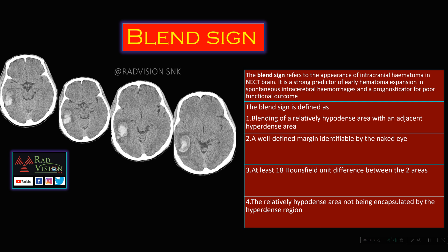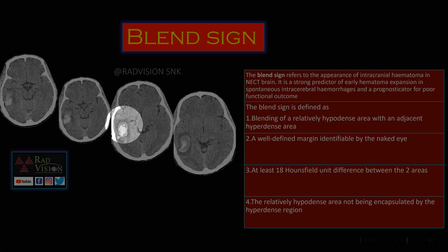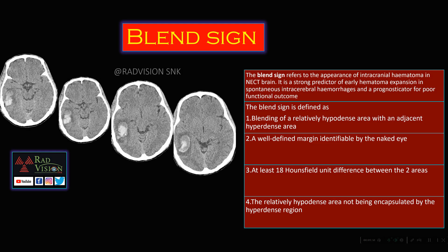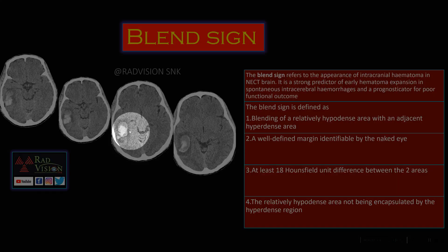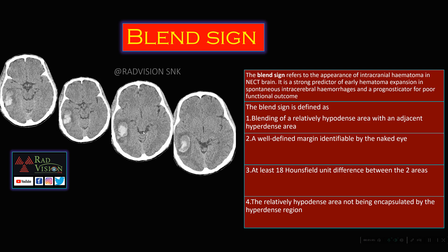Four criteria define the blend sign: blending of a relatively hypodense area with an adjacent hyperdense area; a well-defined margin identifiable by the naked eye; at least 18 HU difference between the two areas; and a relatively hypodense area not being encapsulated by the hyperdense region. Here you can clearly see the margin between the hypodense and hyperdense areas. This is the typical blend sign and is a predictor for hematoma expansion.